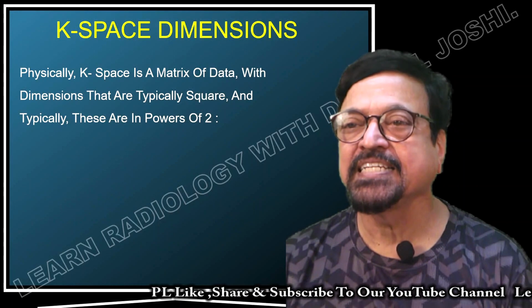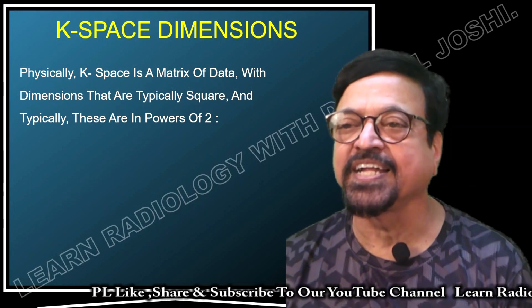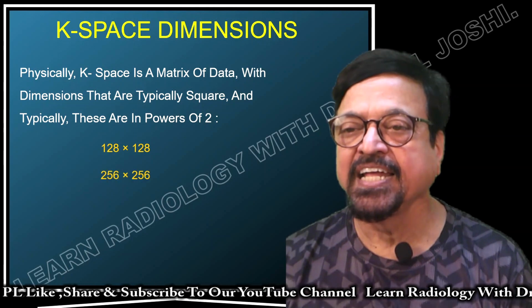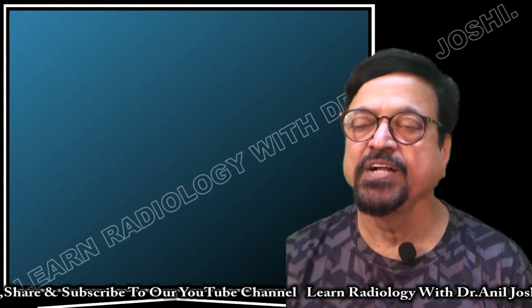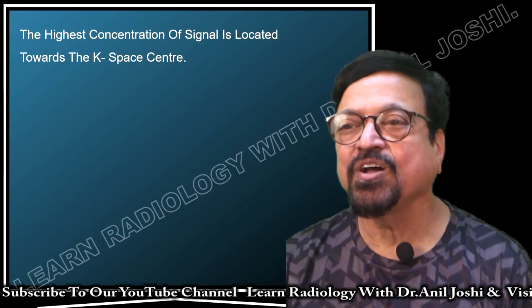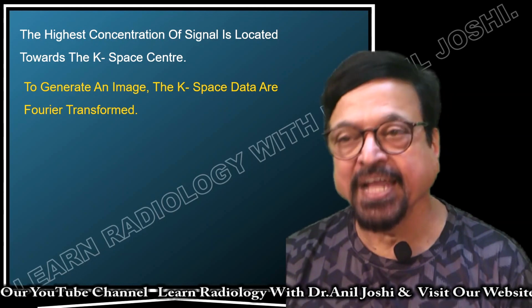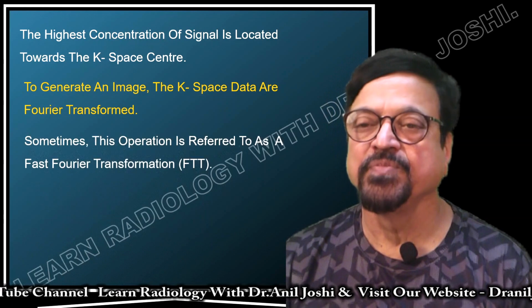Physically, k-space is a matrix of data with dimensions that are typically square, and typically these are a power of 2, like 128 by 128, 256 by 256, 512 by 512. The highest concentration of the signal is located towards the k-space center. To generate an image, the k-space data are Fourier transformed.